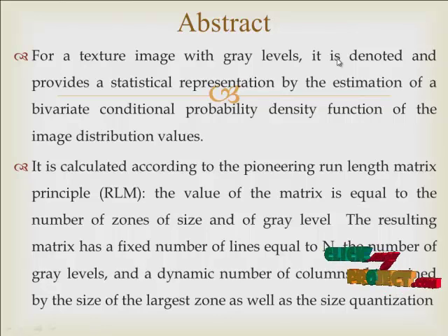Although many systems consider abnormal cases, there is an apparent scarcity of systems performing within class classification of malignant cases. Such systems are quite useful in the prognosis part. With the help of such a system, the doctor can easily identify the class of malignancy, and this will help in deciding the right treatment path. Such a system will also be useful in the later part of treatment, where the doctor can analyze the progress in the patient's condition by comparing images collected at different stages of treatment.